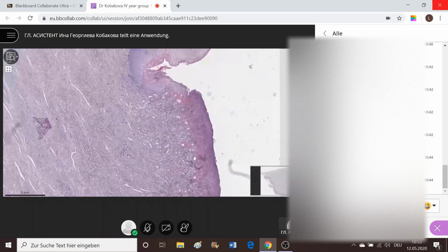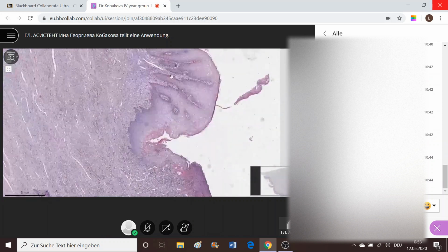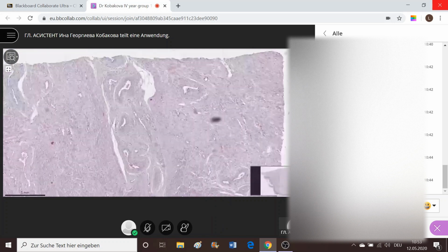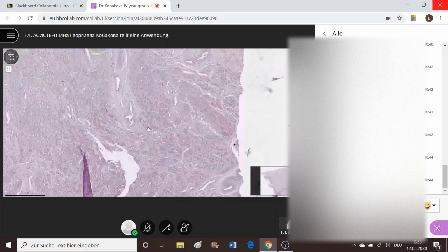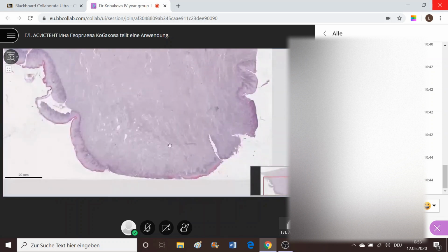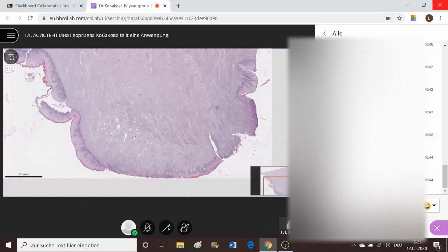And here further, we may observe again some squamous epithelium up to the end of the cervix, which might be marked here or deeper cut. So we suggest that by this process and by the changes that we observed here, this is cervical tissue along with the epithelium, which is missing on a couple of portions.